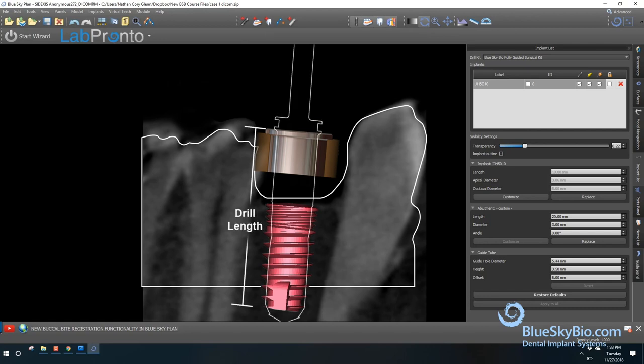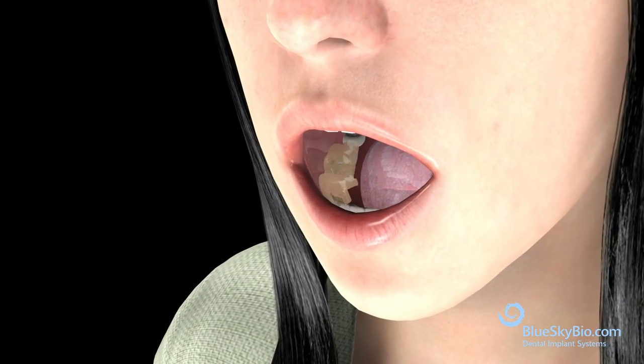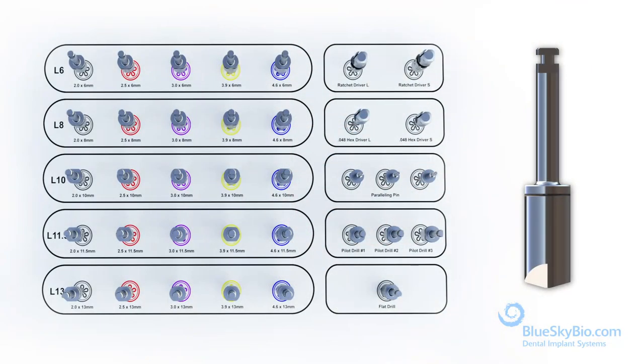The drill length creates the osteotomy at the perfect depth for the relevant implant. Print the surgical guide and insert the metal cylinder. The fit of the guide should be verified before the surgical procedure. The drill flat profiler should always be the first drill used in any surgery.